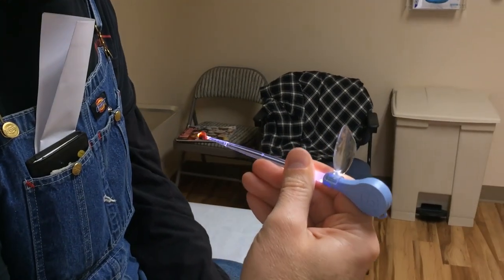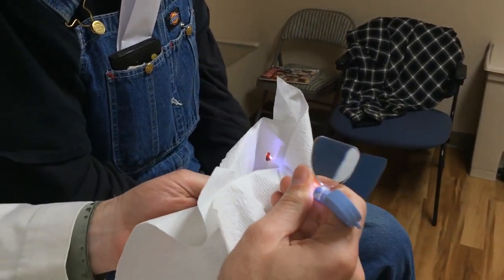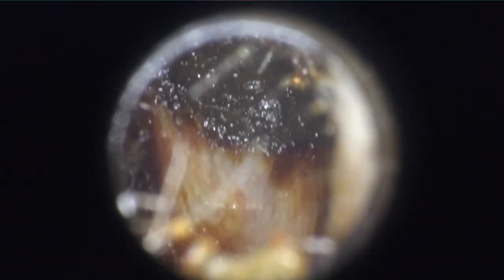We're getting there, we're getting some. Am I hurting you at all? No, not a bit. Just when you were poking really hard.